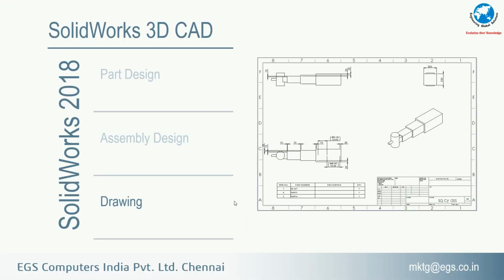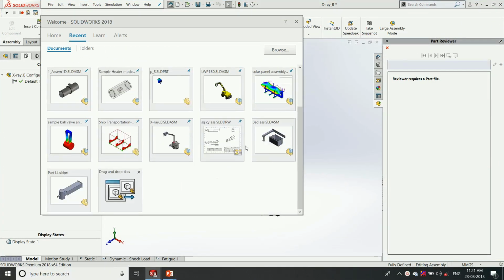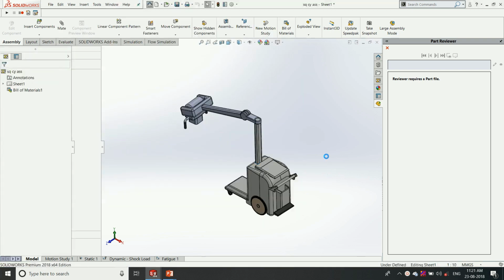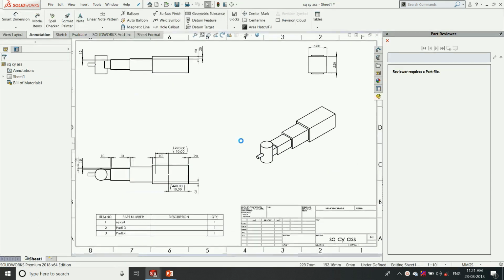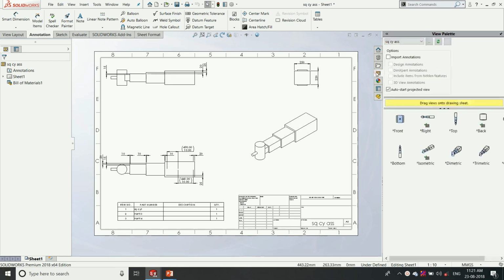Now we are going to see that after designing the component, it needs to be sent to the manufacturer for manufacturability. Once we have designed a 3D model, we can create a manufacturing drawing with simple drag and drop options. In this option we have a list of views where we can choose the top and right view, which depends upon the manufacturer's requirement.